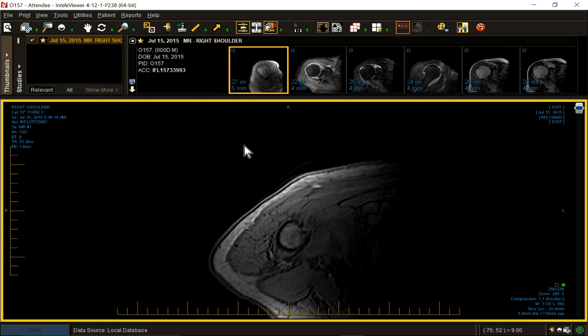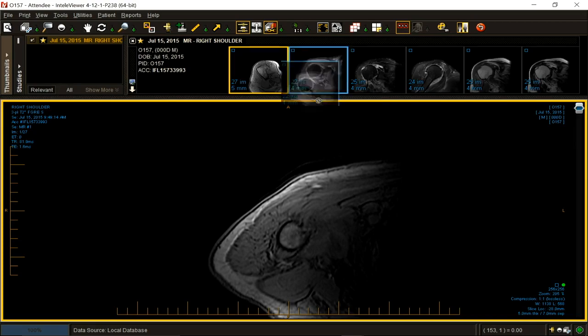The patient fell on Thursday. The problem is I don't know what day it is today. Thank you. I think that means that the MRI is pretty acute relative to the actual event.